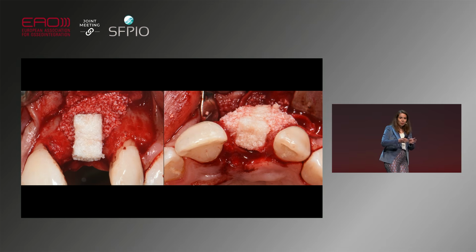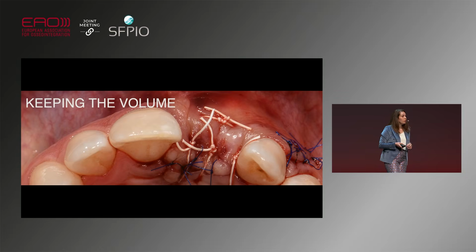The long part of the L goes over the implant threads, and the little part goes over the top of the implant, not necessarily to gain more bone, but to enhance the soft tissue profile. I adapted the membrane, and I closed the flap.